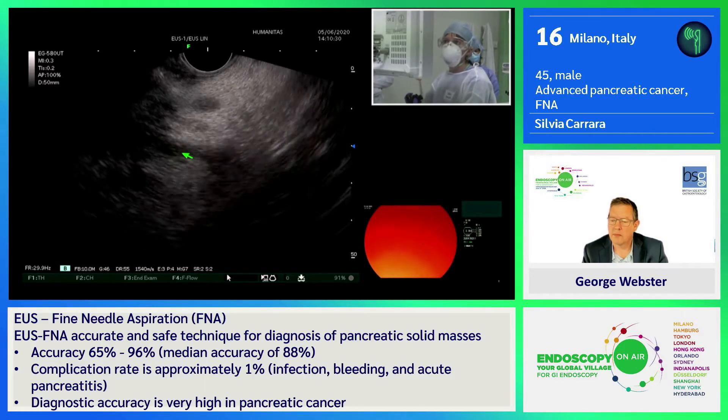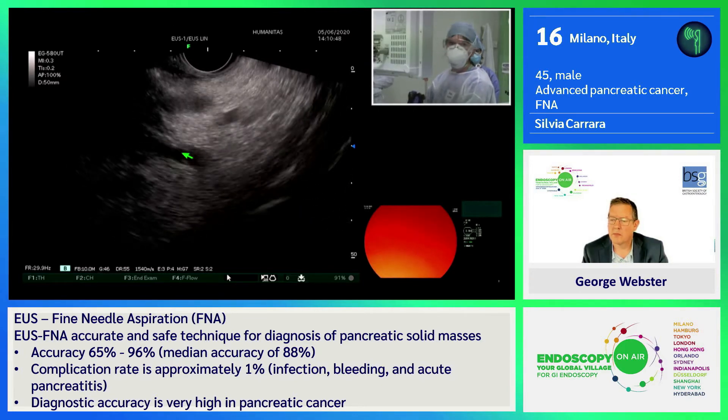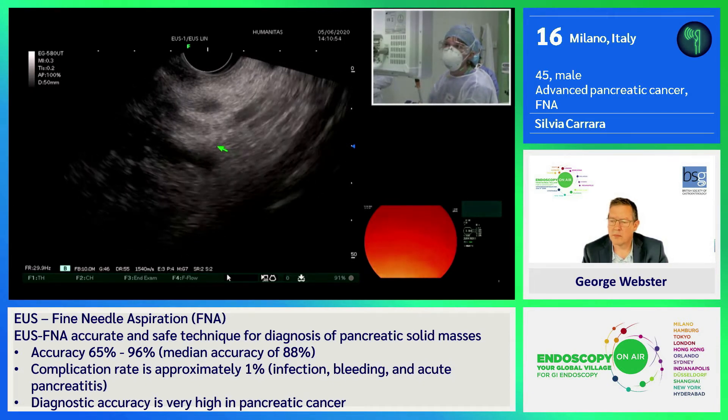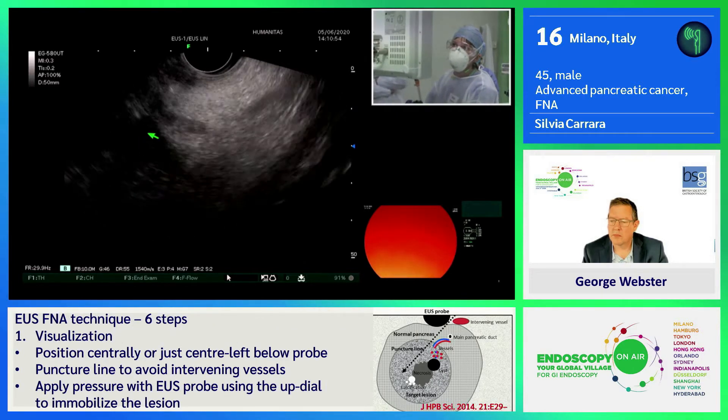I'm using a Fujifilm echogastroscope connected to the SU1 ecoprocessor, and we have a very good picture. You can see the jejunal vessel going to the mesenteric vein.